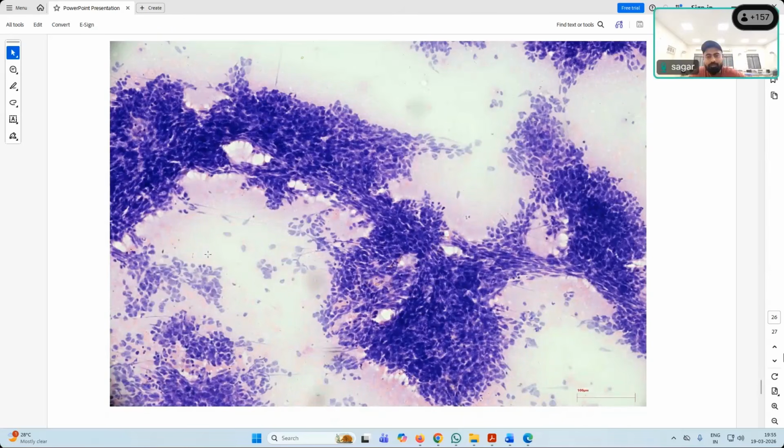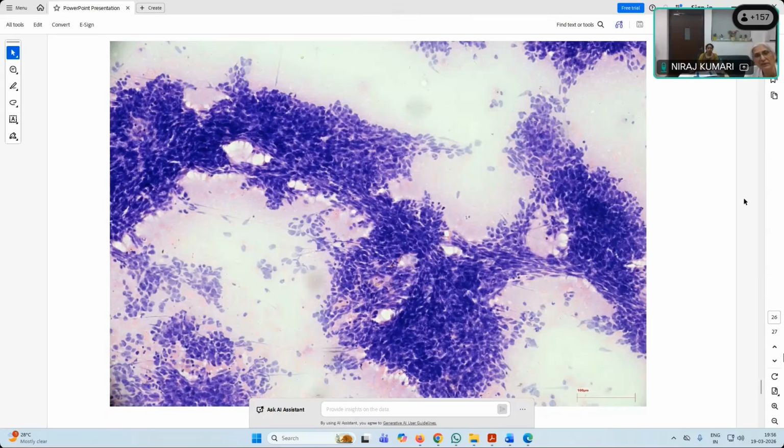These are papillae. Not exactly. Maybe some capillaries are there. It is not exactly papillary because you see a lot of cells on one side of some fibrovascular structures. It is not forming papillae. Here again you can see some dispersed cells, loosely cohesive structures but with some overlapping.